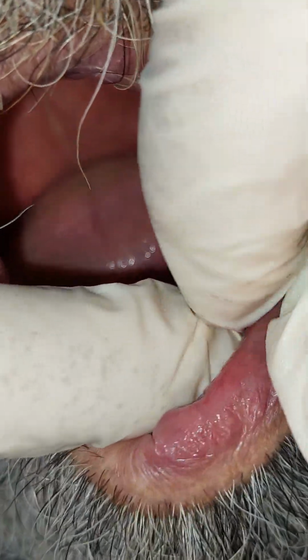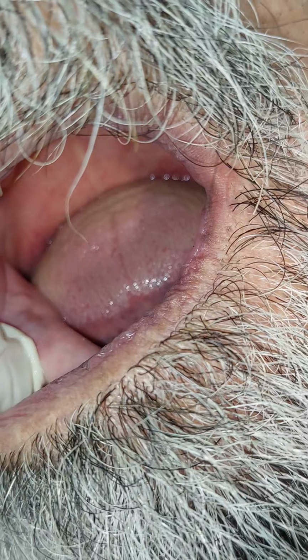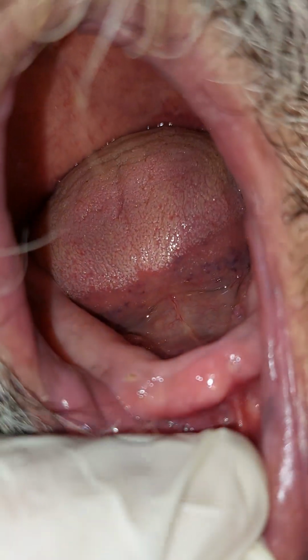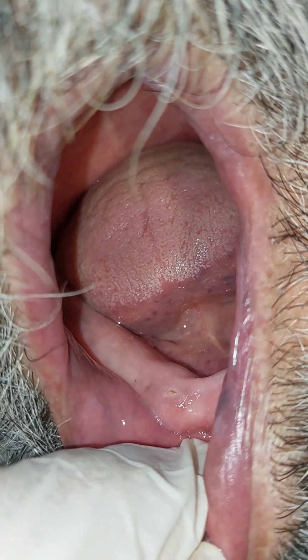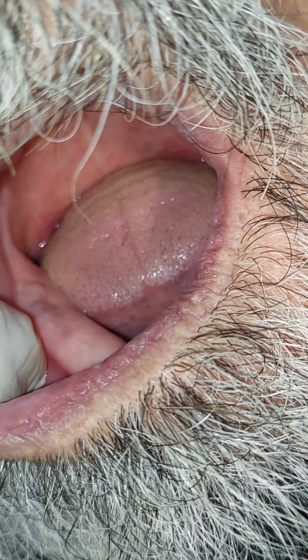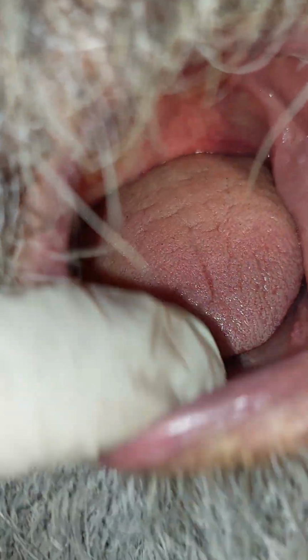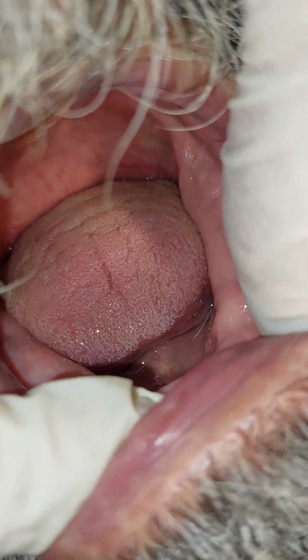So how do I do that? By blocking all of the undercuts on the cast. Using some blockout material on the stone, I eliminate these undercuts. So the denture will go into an undercut, but not immediately on the shelf area. It will go smoothly from here down here, diagonal, without going into the undercuts. There is another way, which is totally making the denture parallel, not at all going in an undercut direction. And this we could do especially in the lingual areas. But in this case, I would recommend surgeries.